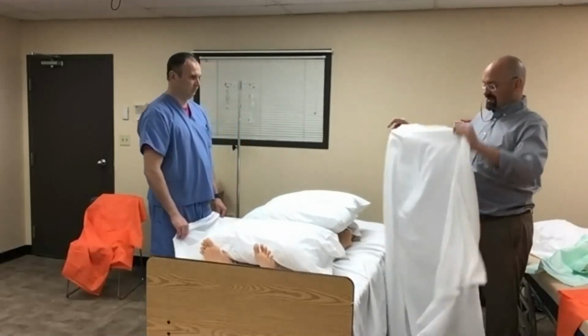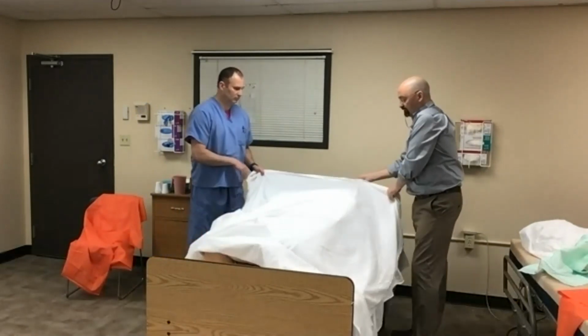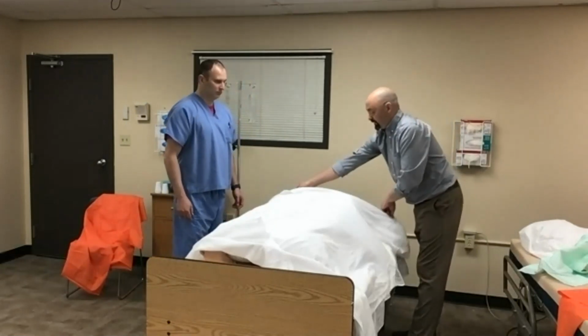You're going to take a second flat sheet. The patient is on a flat sheet. You're going to use a second flat sheet. You're going to pull it up and then fold it over. So you're going to have about 12 to 14 inches. So the head and airway are open here.